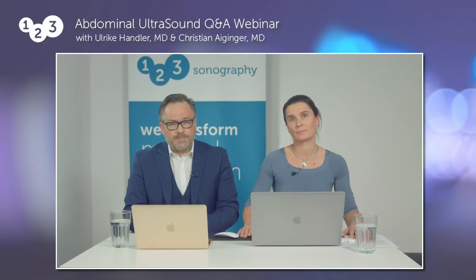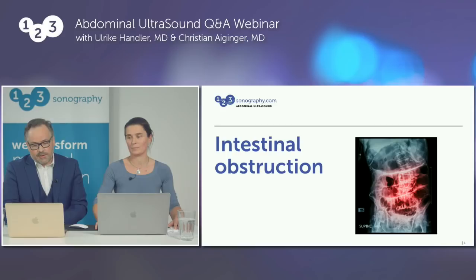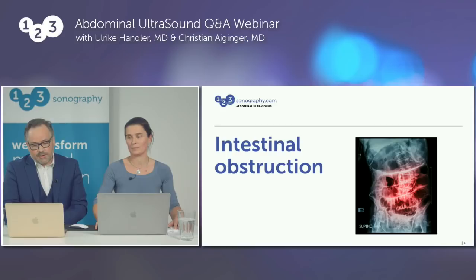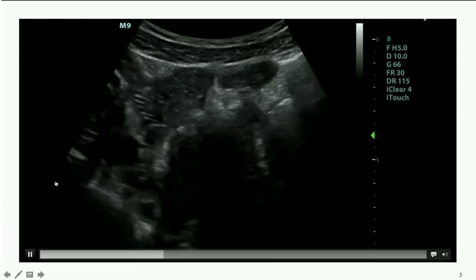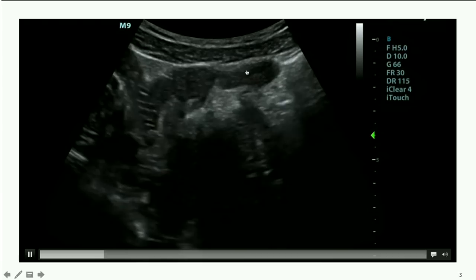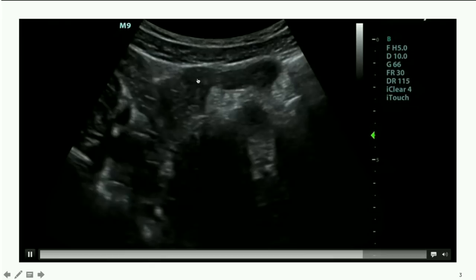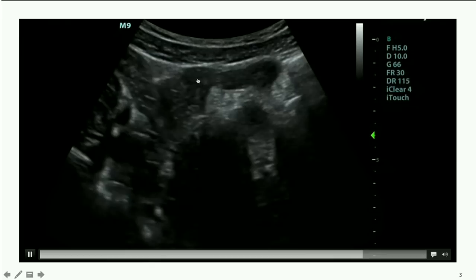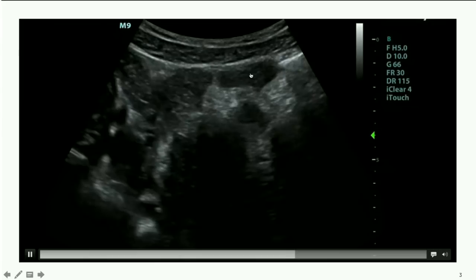Let's take a look at normal intestinal bowel loops. We can see these perfectly normal bowel loops: they are fluid-filled, quite small, less than two centimeters in diameter, and there is propulsive peristalsis. These are really healthy, normal loops of the small intestine.